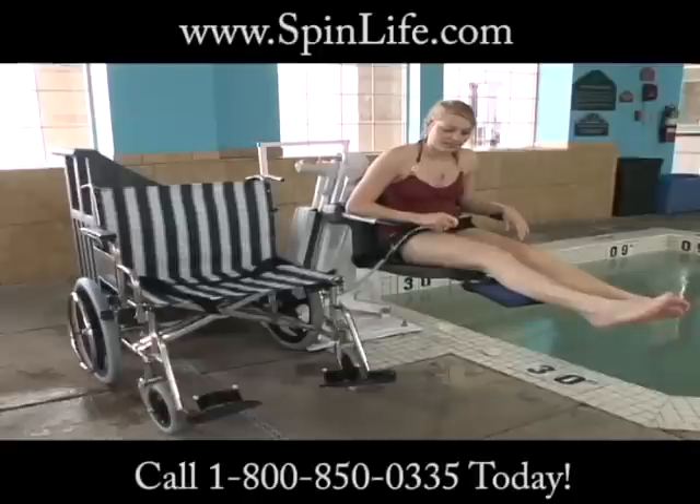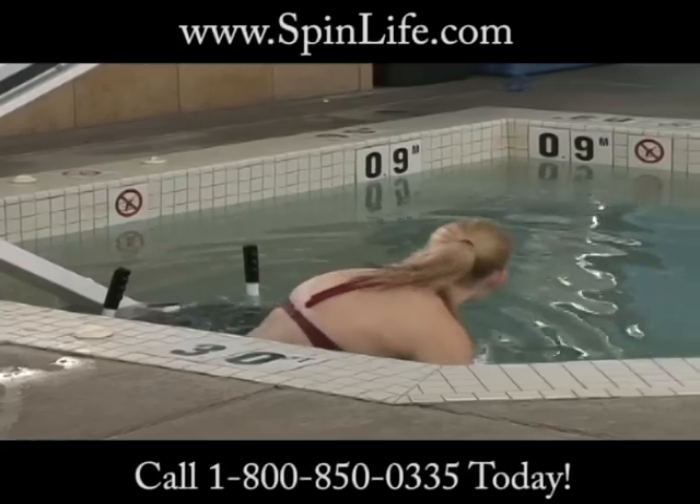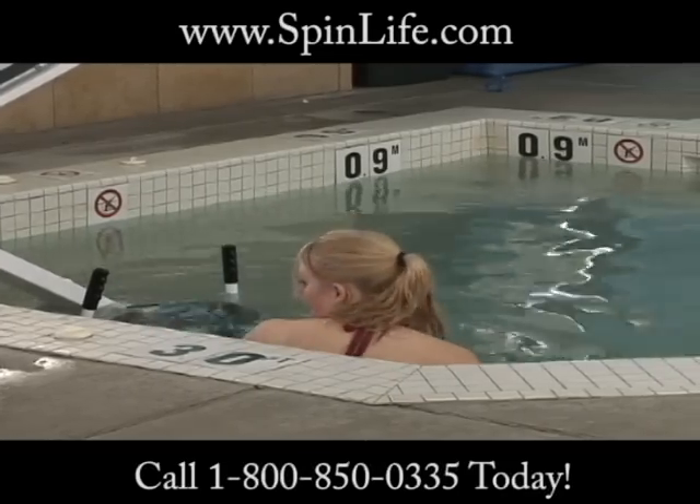Whether for therapy or for simple enjoyment, the Patriot Portable Pro Pool Lift provides those with mobility issues the ability to enjoy their pool or spa again.